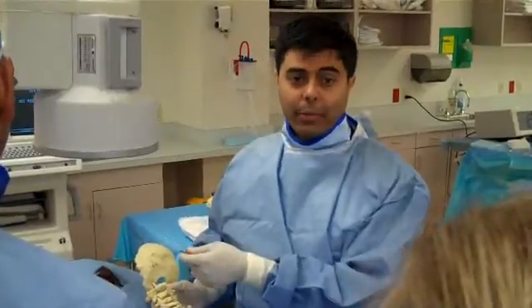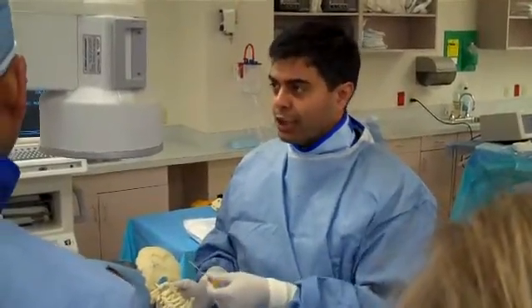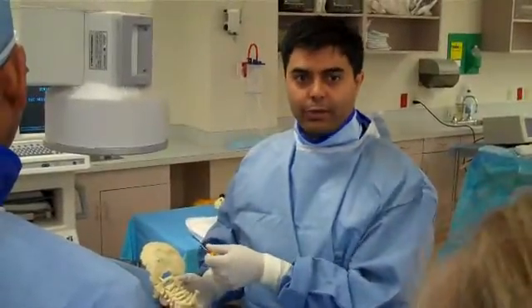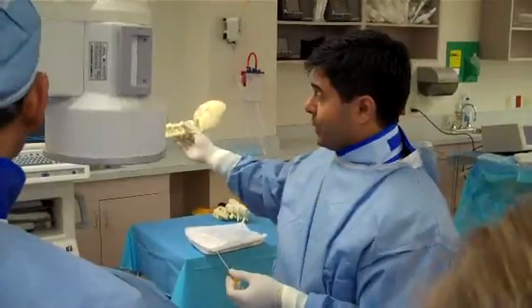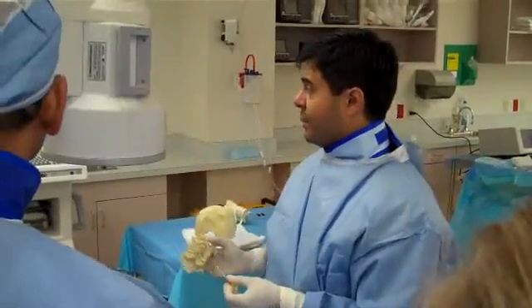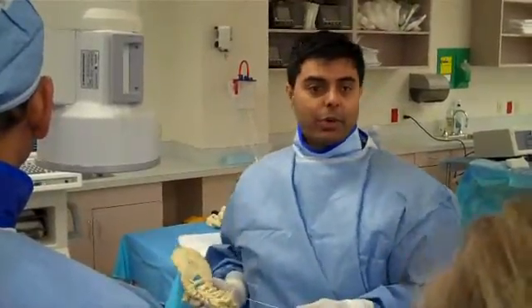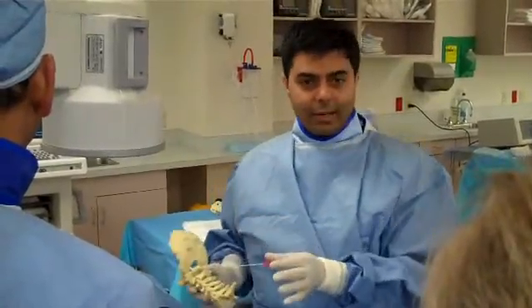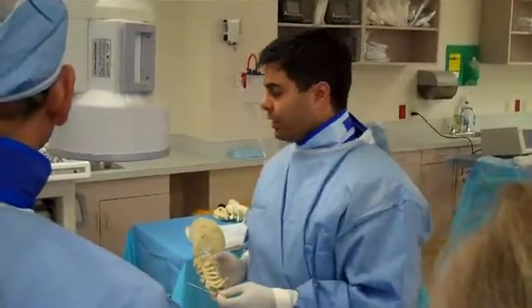This is actually a really good cadaver to do this in. It's very osteoarthritic — looking at that overlap over there, it looks like a very challenging kind of patient. So if you can do it on this cadaver, it's not going to be an issue. You can go and do it on your patients when you get back.